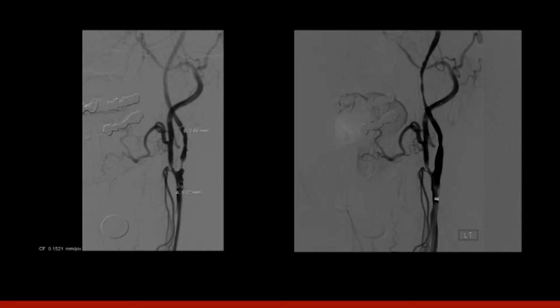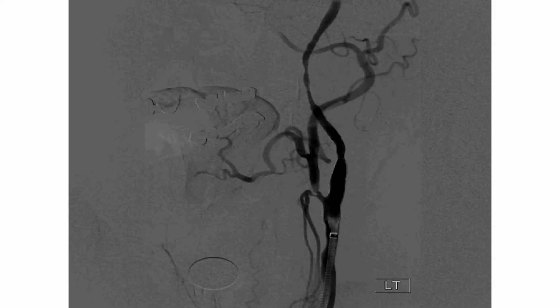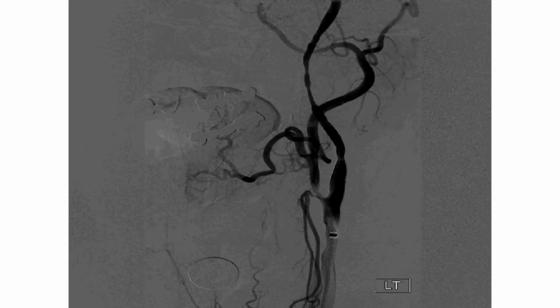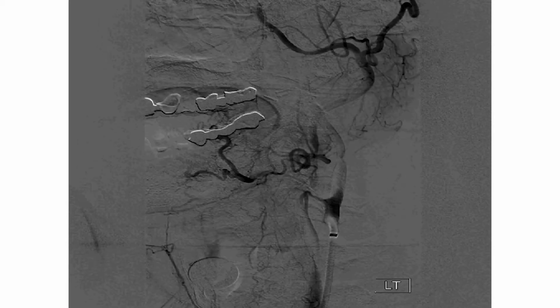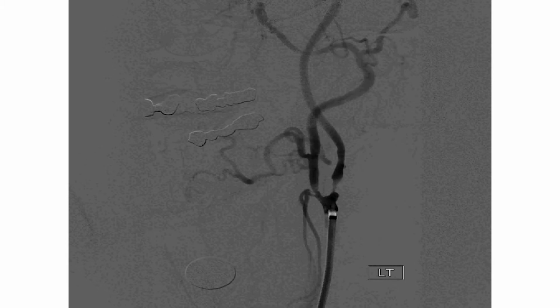So here's an example of radiation-induced stenosis. So you see this very tight, narrow lesion here that was right in the plane of where this person was radiated. So rather than a plaque, it's all just extremely narrow from scar tissue. And this is after angioplasty and stent. Here's sort of dynamic pictures. So before, so this is the internal carotid and the external carotid and the common, and this is after. So there you can see the outline of the stent right there. And it's now completely reopened.